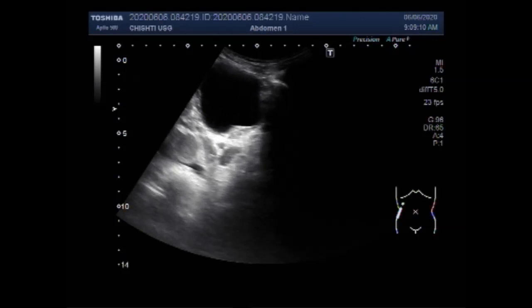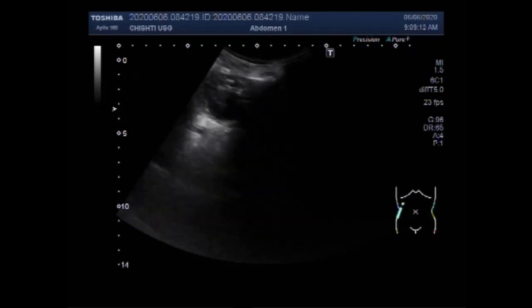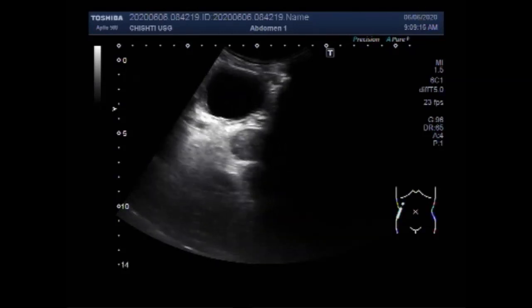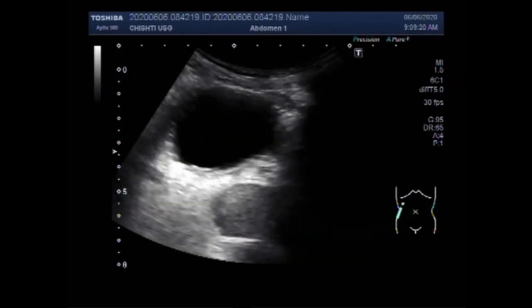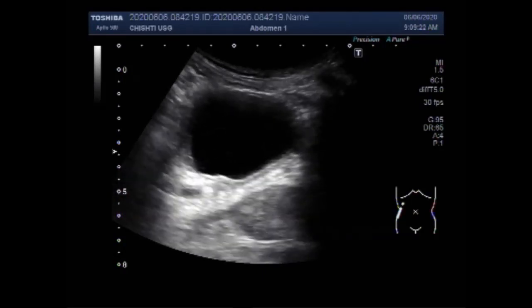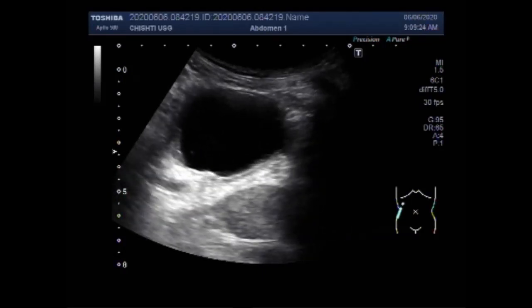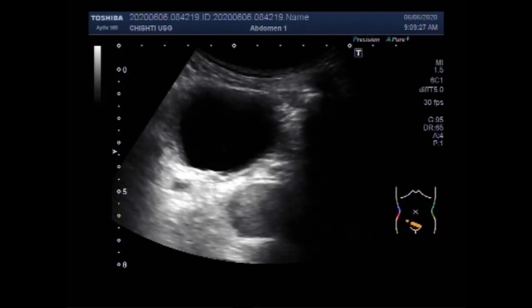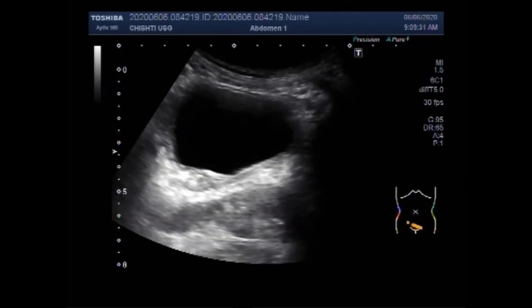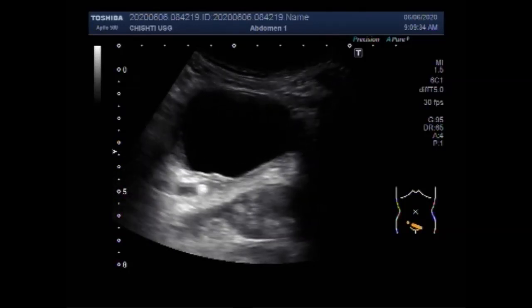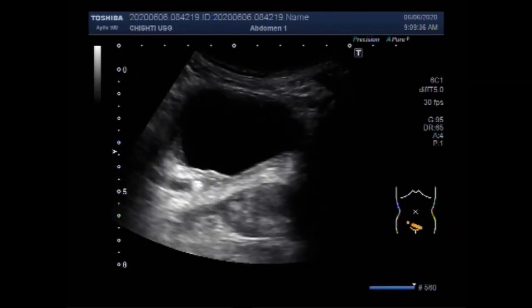Now this is the urinary bladder and you will see a tiny stone, a small stone of about 6 mm in the distal portion of the ureter near the ureterovesical junction. Ureteric stones are kidney stones that have become stuck in one or both ureters — the tubes that carry urine from kidney to the bladder. If the stone is large enough, it can block the flow of urine and this blockage can cause severe pain.